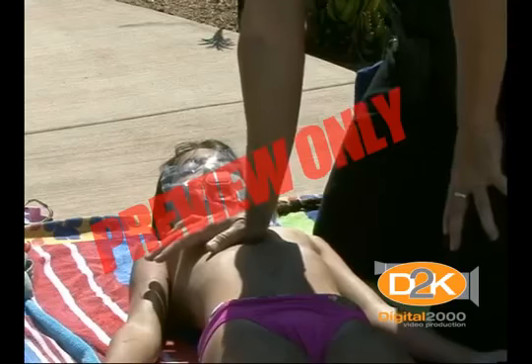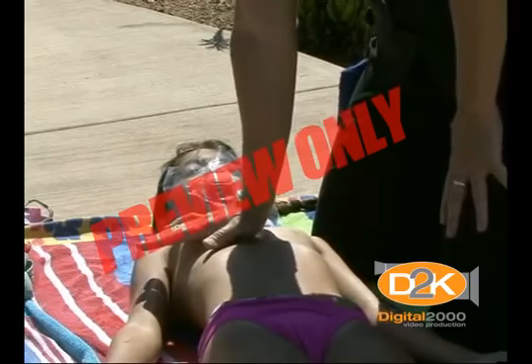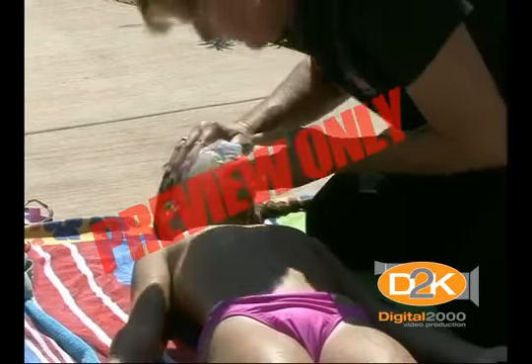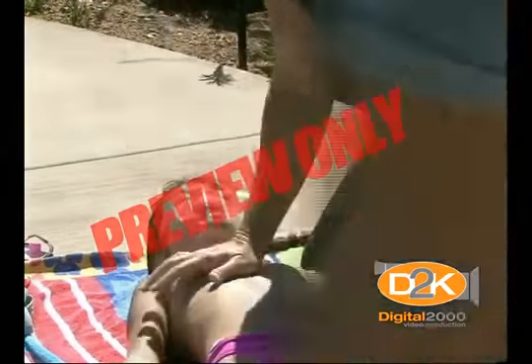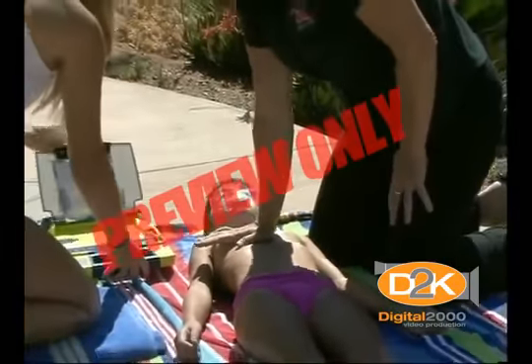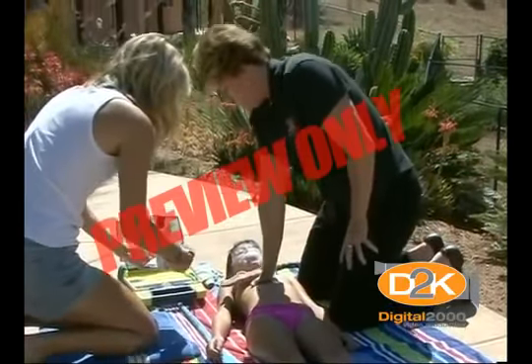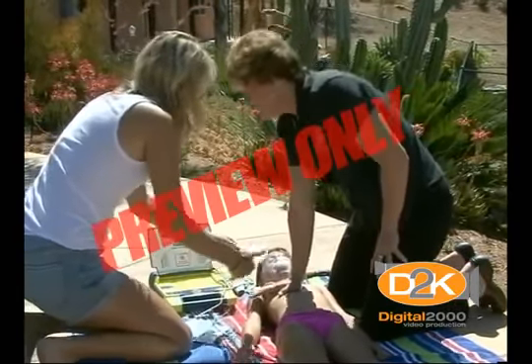1, 2, 3, 4, 5, 6, 7, 8, 9, 10, 11, 12, 13, 14, 15, 16, 17, 18, 19, 20, 21, 22, 23, 24, 25, 26, 27, 28, 29, 30. Here's the AED. Oh, great. 911 is on its way. Great, thank you. 3, 4, 5, 6, 7, 8, 9, 10. Good, great, thanks. 11, 12, 13, 14, 15, 16, 17, 18, 19, 20, 21, 22, 23, 24, 25, 26.